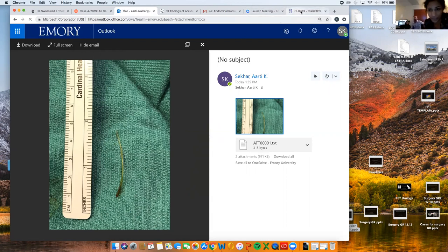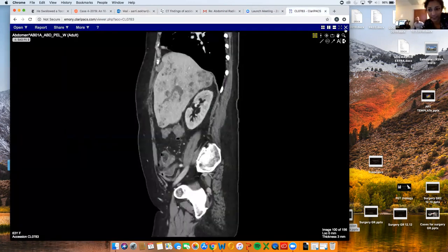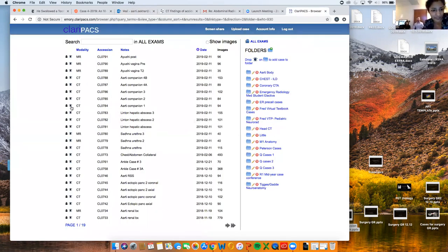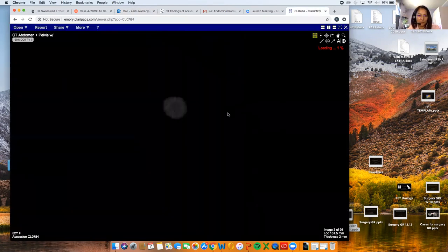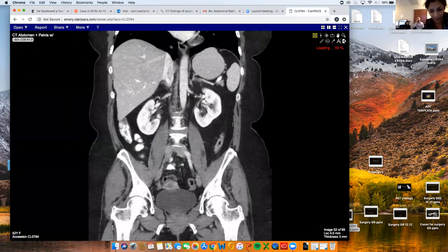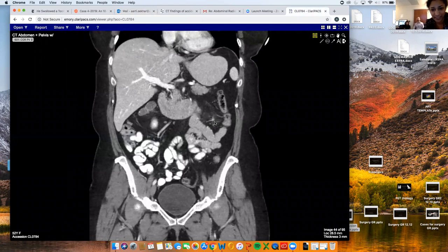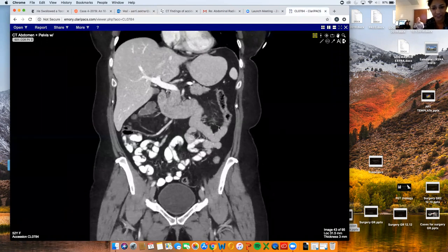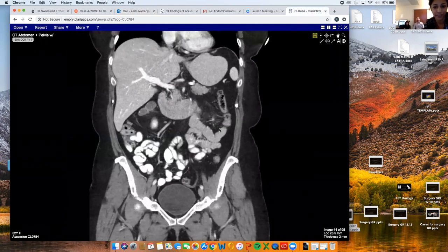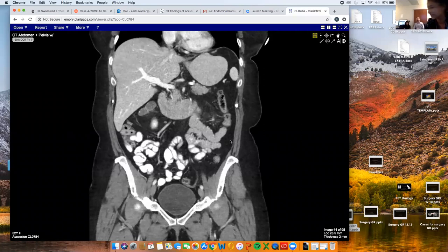So we have a couple of companion cases. I find the coronal view to be helpful — for example, this one here is another extruded fish bone with some inflammation around it, completely not even next to the bowel, no free air. On the axial it just looked like some smudgy stuff, but on other views you can see it. They've decided to leave this one, so she has some follow-up CTs and it's still there.